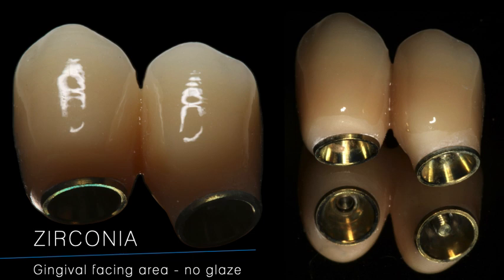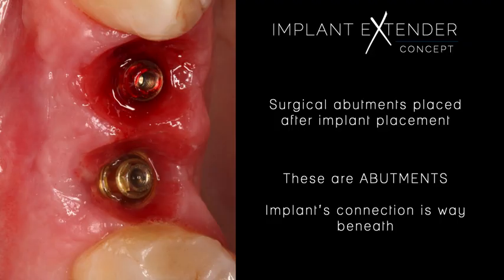This is essential that your technician should not glaze the zirconia, because as the zirconia comes machined, this machined part of zirconia will be the best surface for you to get into contact with the gingiva, because fibroblasts will proliferate and will grow and will attach to this surface.